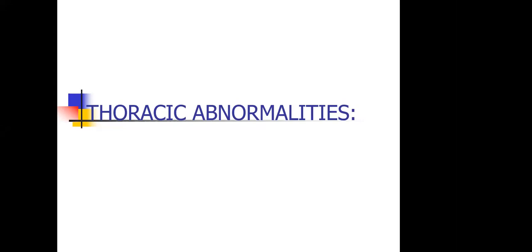His first question relates to CT, and he's asking about high resolution CT and then the spiral CT. So when you talk about high resolution CT, it's just a protocol. It's just one method of scanning the thorax, which is actually present in that CT scan, for example, the one we have here in the hospital.